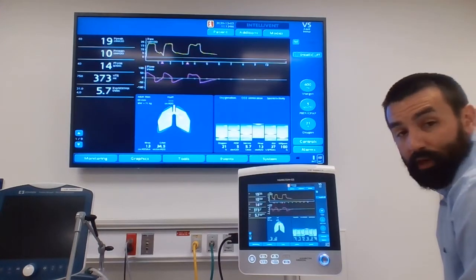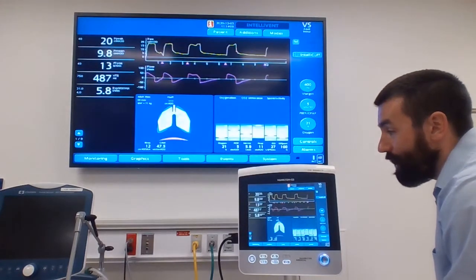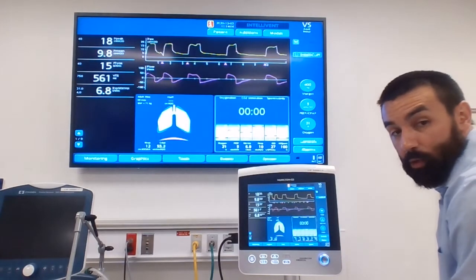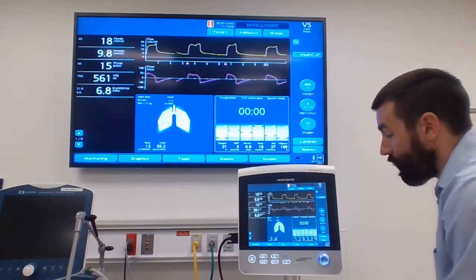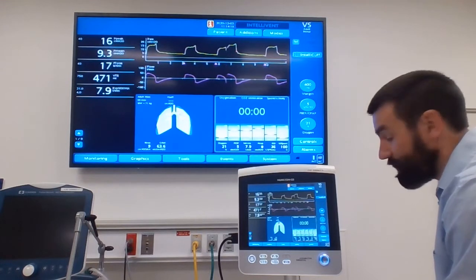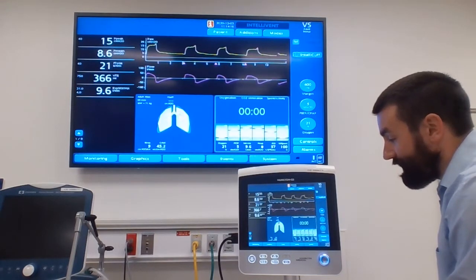Well, just like with pressure support, think about it. Instead of you setting pressure support, you're setting the target tidal volume. We have to evaluate how much force it takes from the ventilator to achieve that patient's targeted parameters. So if you pull up this vent status panel in the bottom right, it'll show you this patient's breathing 100% spontaneously.